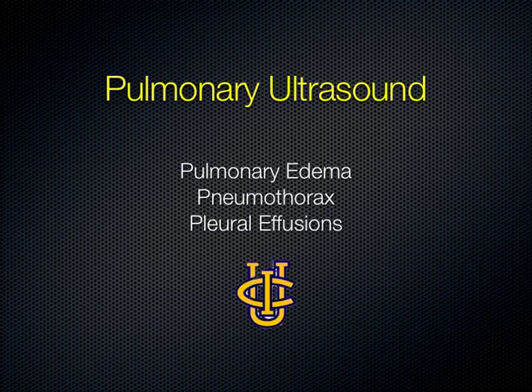And it's just now catching on here in America in the last, say, decade, that we understand that you can actually ultrasound the lung. The prior understanding, and I know all of you have had this multiple times, is that air doesn't transduce ultrasound well, so how could you possibly ultrasound image the lung? Well, what I'm going to teach you today is that we don't so much look at the lung as we look at the artifacts created by the ultrasound waves that travel through the lung. And that tells us a lot about what's going on with the underlying tissue.